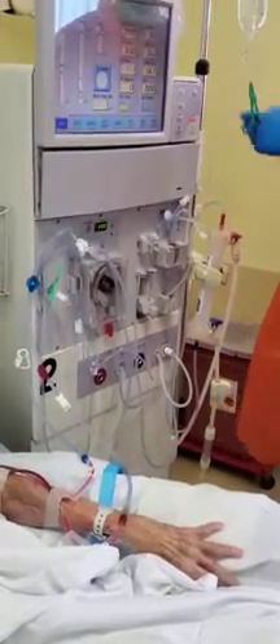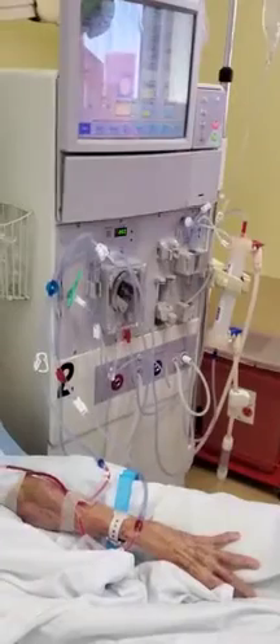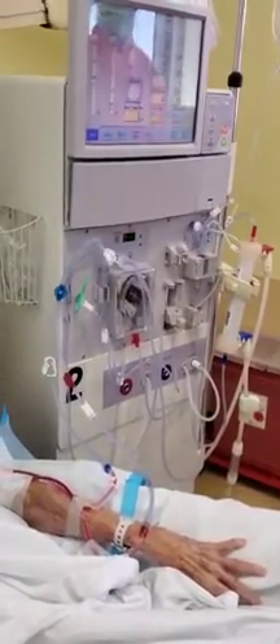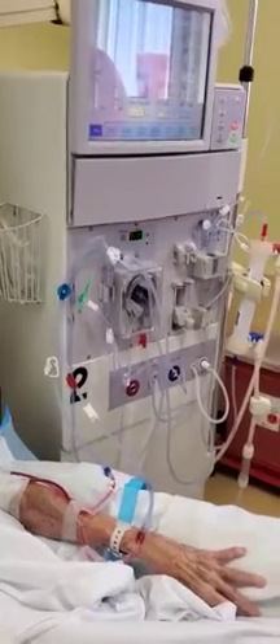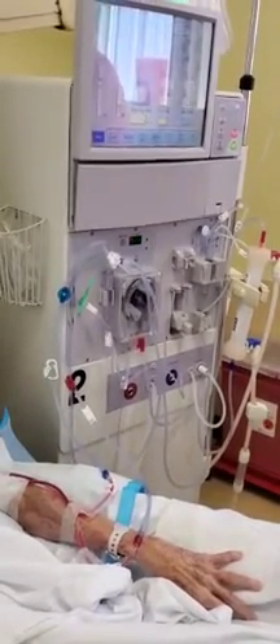He's going to change his gloves now because he's touched some blood — a minute amount as it might be. He changes his gloves, and now he's going to start the blood pump.